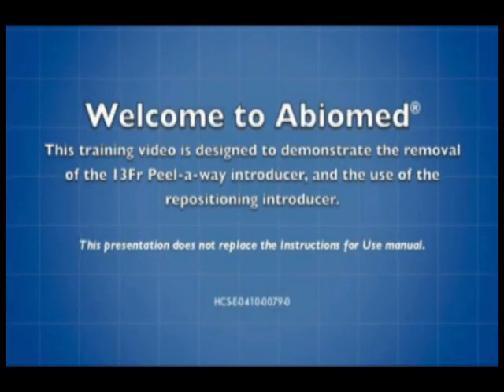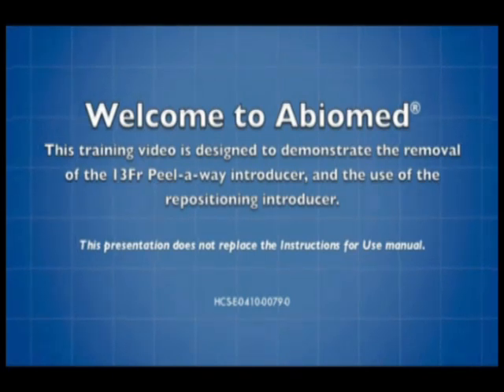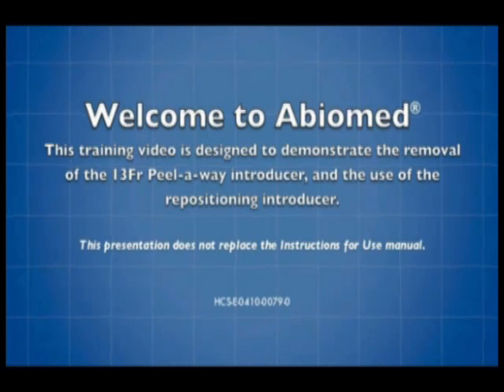Welcome to Abiomed. This training video is designed to demonstrate the removal of the 13 French peel-away introducer and the use of the repositioning introducer. This does not replace the instructions for use manual.